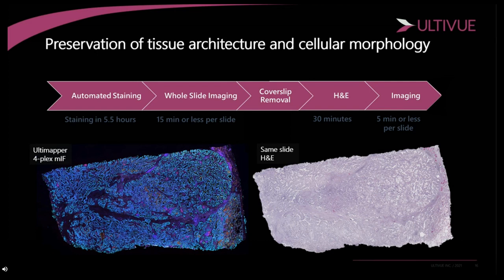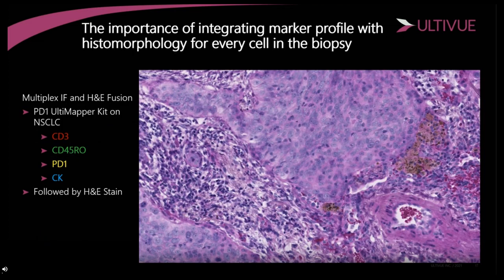But it is something extremely powerful, especially from the fact that it adds the phenotypic and functional information to an image that is what pathologists look at, and gives them the morphological features that are eventually driving diagnosis, for example. So if you look at this image, a pathologist would be really comfortable in saying what is tumor and what is stroma, but also it would be easy for a pathologist to say as well that there are a lot of infiltrating cells.